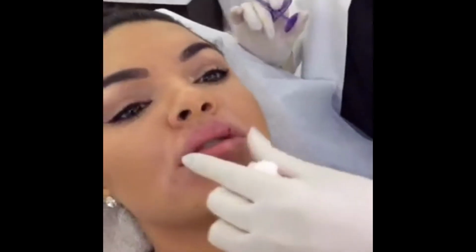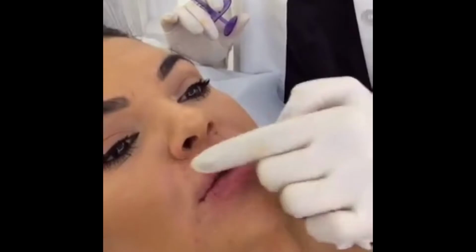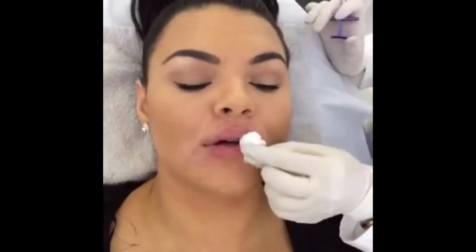So the first part of the injections is really just concentrated on the body of the lip to give the full volume look. Now I'm going to work around the contour of the lip to try and just give a little bit more contour on this lip liner look. But a lot of people out there really focus on just doing the edges of the lip, and this is when they create this really unnatural ridge. Yeah, it sort of gives them a moustache.